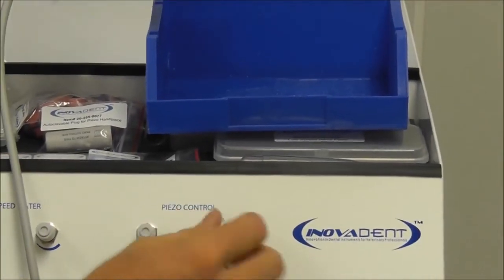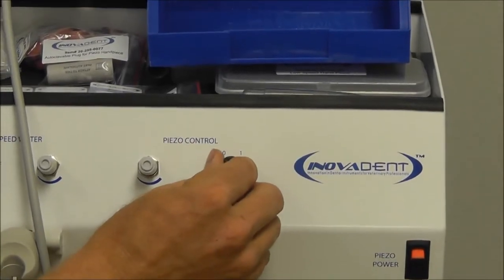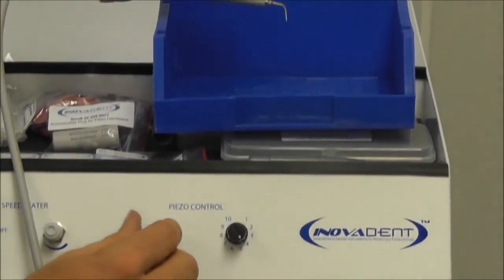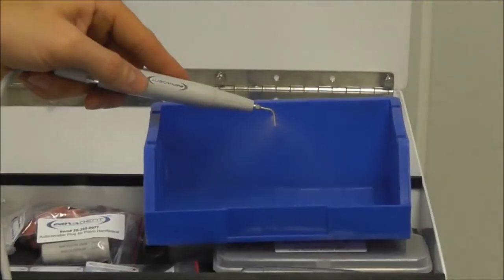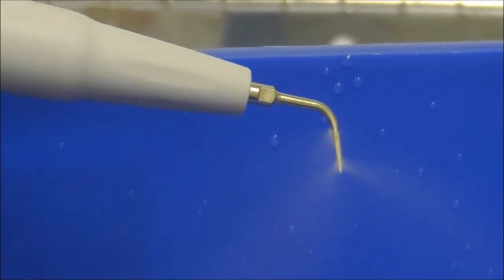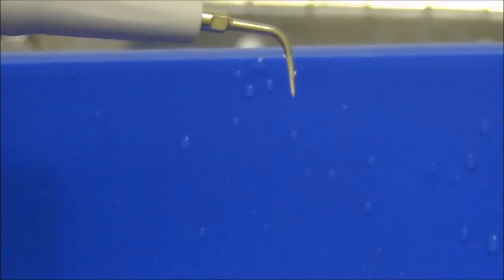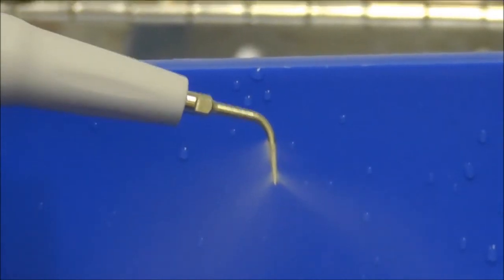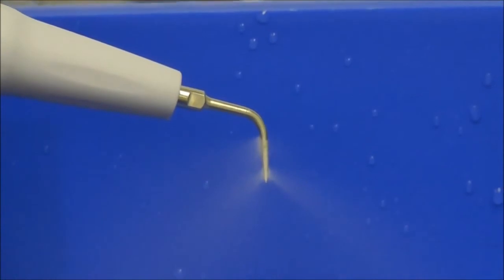And we'll set our water, making sure our switch is turned to the on position for our piezo. Bring our power up a little bit, and we want it just so it jumps off the end of that tip, just like so. The water is actually coming out of the corner here, but we want it to come off the tip, so if we go subgingivally, we're getting irrigation down along the gum line, so we're washing any debris away.